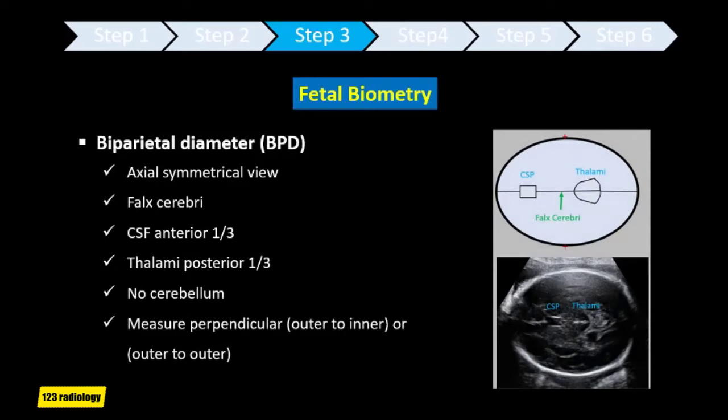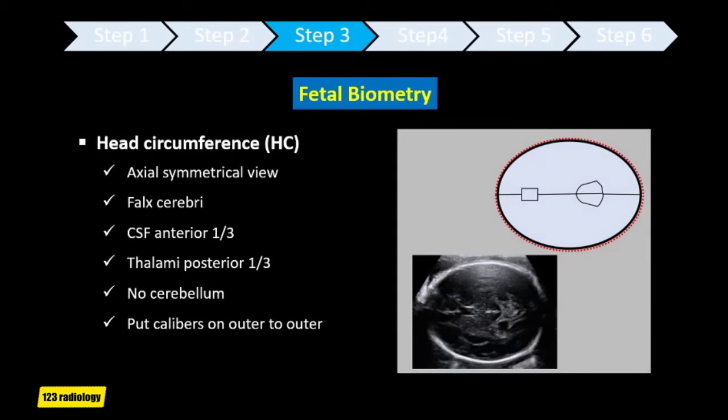Biparietal diameter is measured on a symmetrical axial view at the level of the thalami and cavum septum pellucidum. The cerebellar hemispheres should not be visible in this scanning plane. The measurement is taken from the outer edge of the proximal skull to the inner edge of the distal skull. The head shape may be flattened or rounded as a normal variant, which may make measurement of the head circumference more reliable than biparietal diameter for estimating gestational age. Head circumference is measured at the same level as the biparietal diameter, around the outer perimeter of the calvarium, and is not affected by head shape.